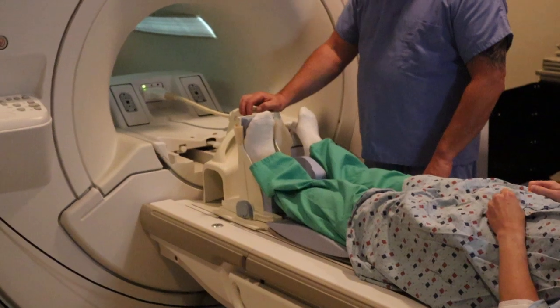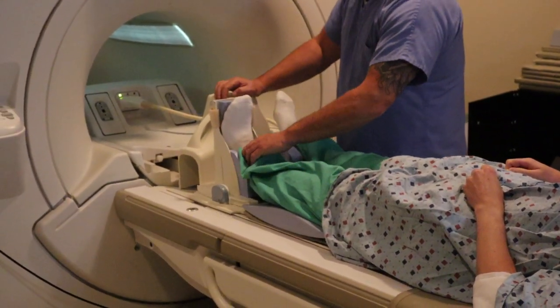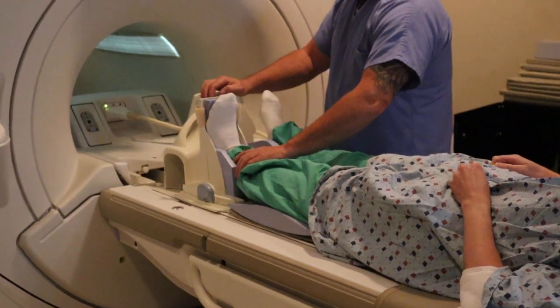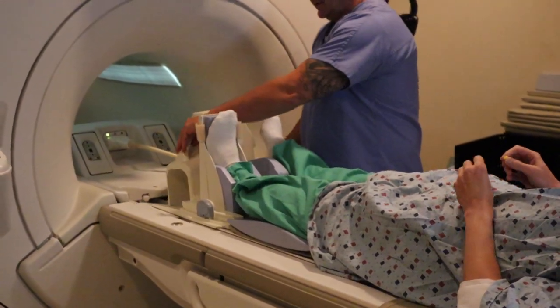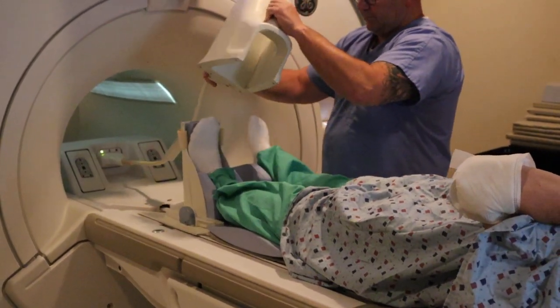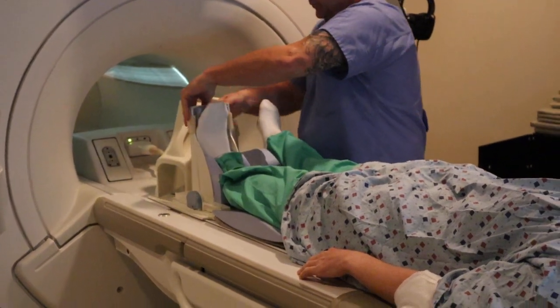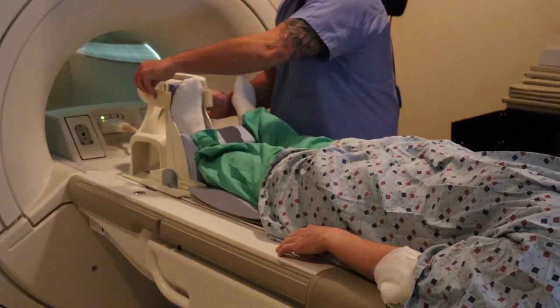Having your ankle or foot dorsiflex will allow the Achilles tendon to be stretched and it will open up the foot and ankle joints. You want to attach the in vivo coil and you want that leg to be straight and in plane.